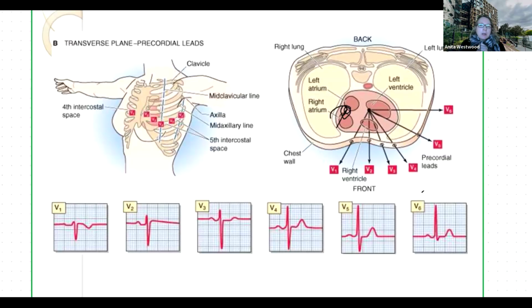So the idea here is there is a fictitious point there that it's referencing from, but the importance for the ECG is that the lead you are looking at, V3, V4, for instance, allows you to access that view of the conduction from that point of the heart. That's the important point, because that's the window we want to look at. The machine's calibrated, they do it all. As long as we make sure it's a diagnostic piece of paper, that we're looking at ECG, the paper speed, the amplitude, the voltage, that it's the right patient, that we've got the leads on the correct way, then the machine will automatically calculate that for us. That's what they're designed to do.